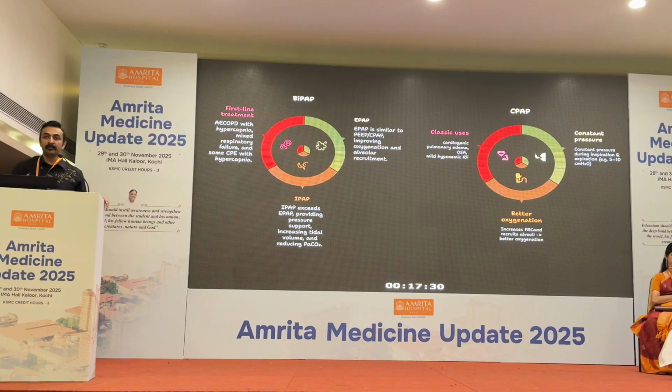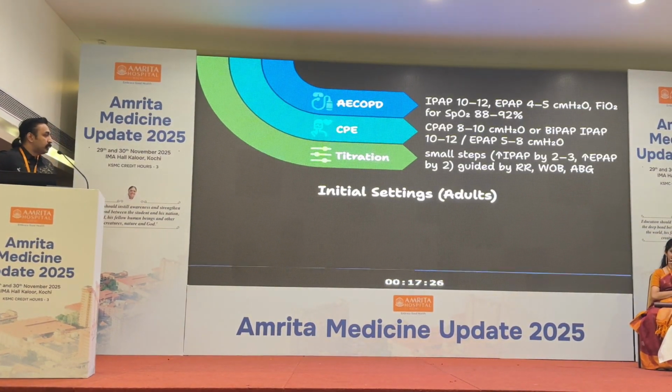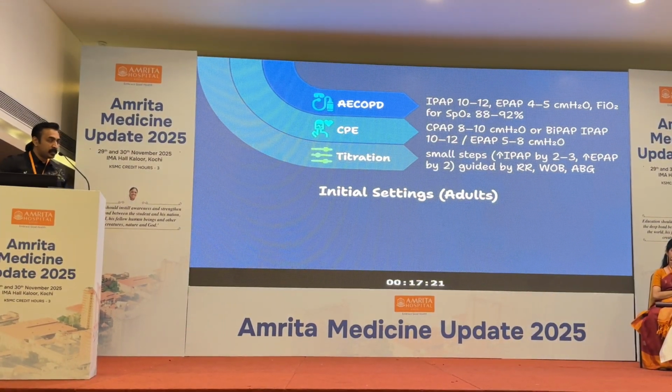There is a definite role in mixed respiratory failure and cardiogenic pulmonary edema with hypercapnia. So, are you with me so far? Right? Okay. Now, what could be a reasonable cheat sheet for the initiation of BiPAP?